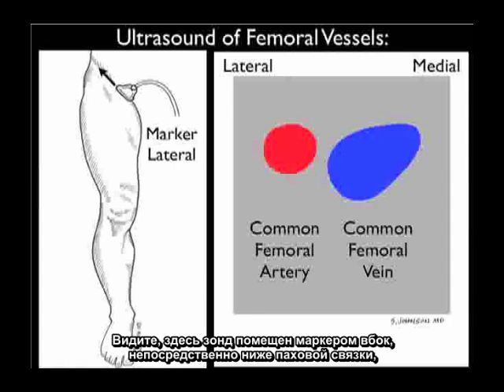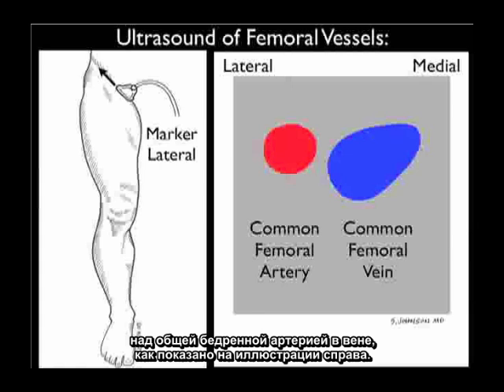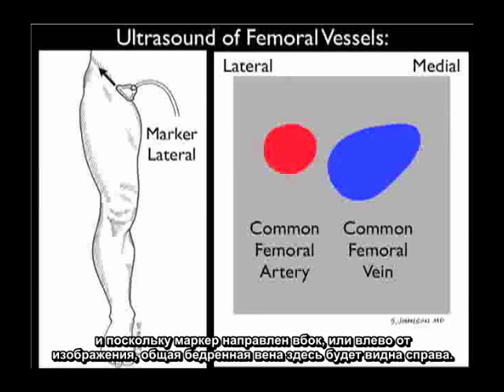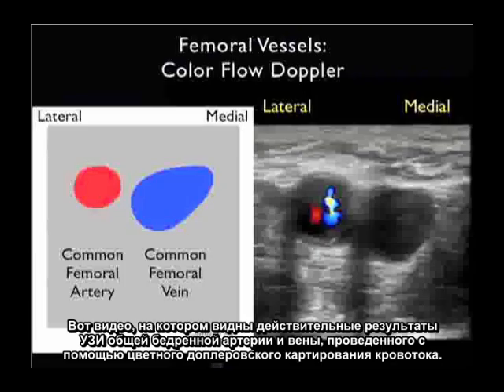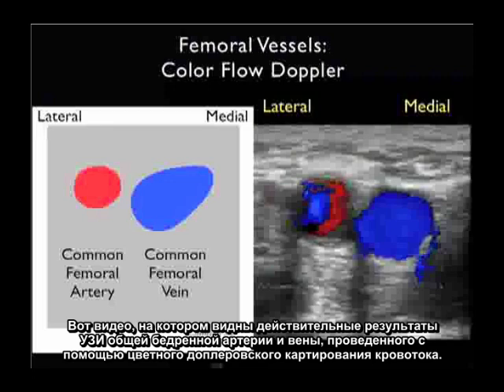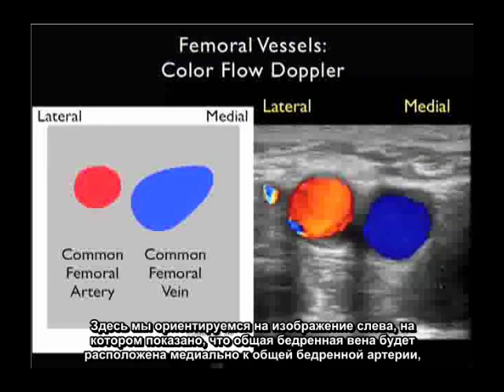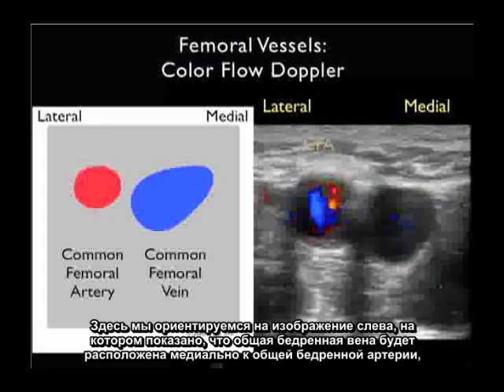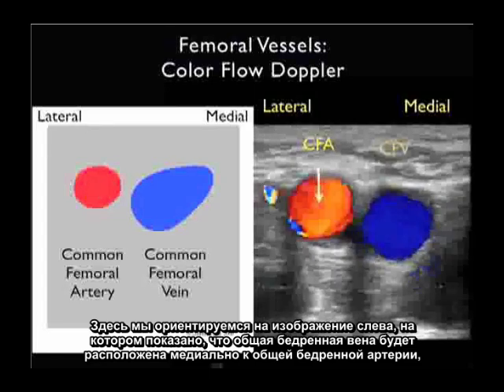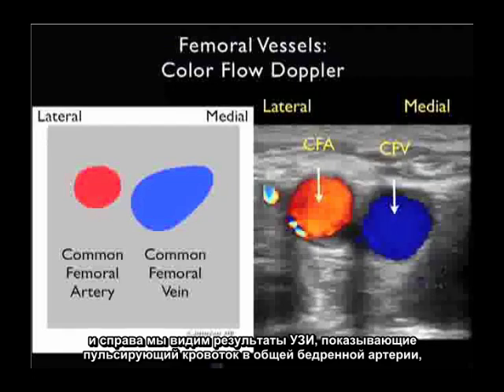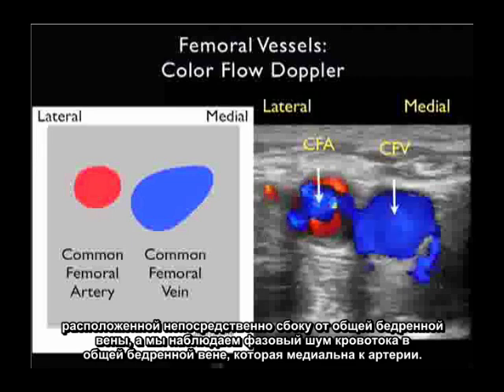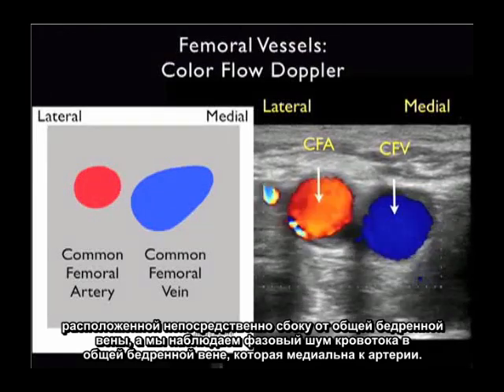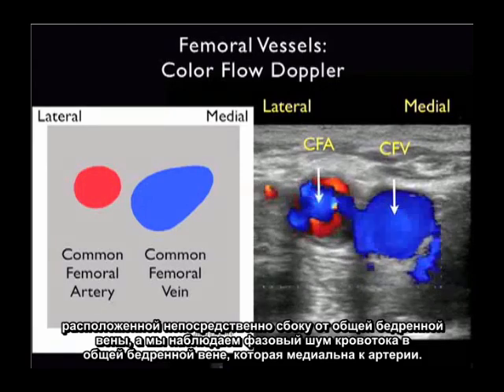Here we see the ultrasound findings with the probe placed with the marker dot laterally, just inferior to the inguinal ligament over the common femoral artery and vein. The common femoral vein will be seen medial to the common femoral artery. Because we have the marker dot oriented laterally or towards the left of the image, the common femoral vein will be seen to the right. A video with color flow Doppler demonstrates pulsatile flow within the common femoral artery located just lateral to the common femoral vein, with phasic flow seen within the vein medially.